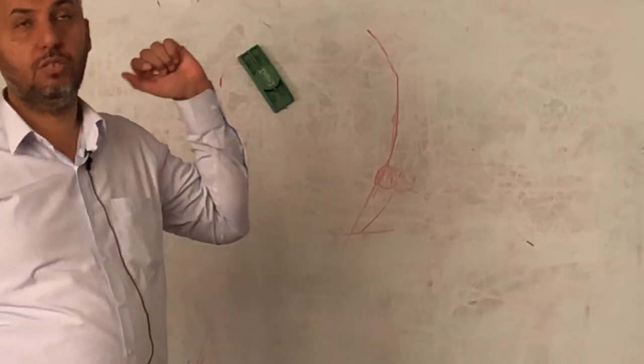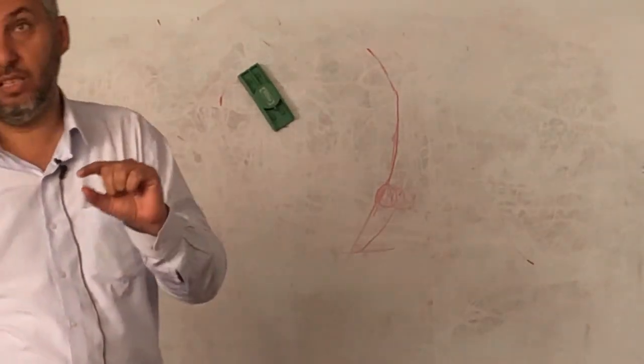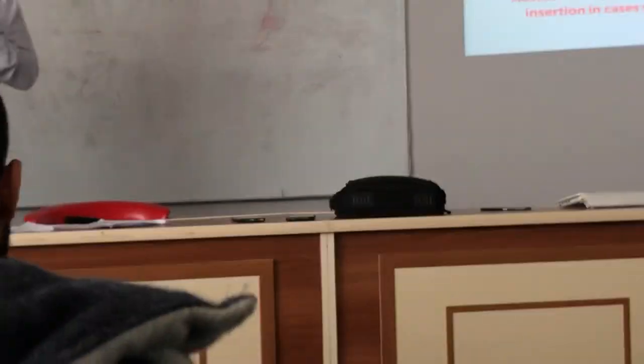In the previous lecture, we said we can change the position of the survey line by several methods. First of all, tilting of the cast on the surveyor. Second, recontouring. Third, restoration. Fourth, crown.